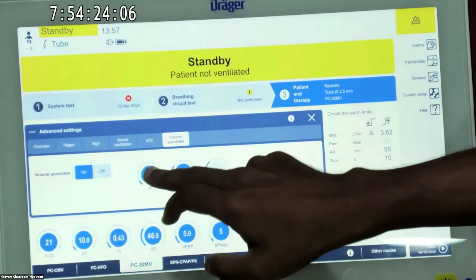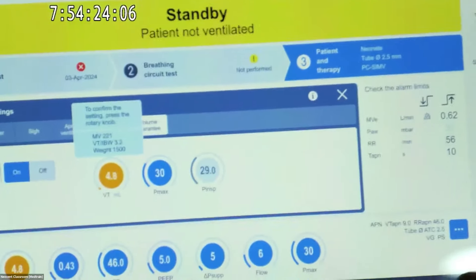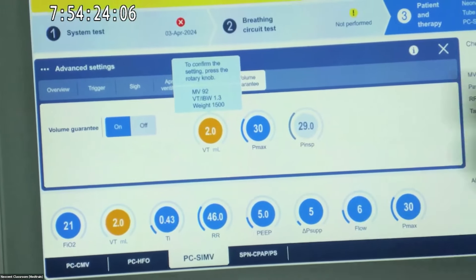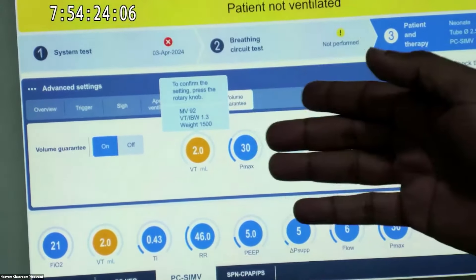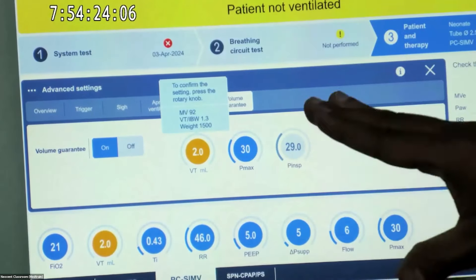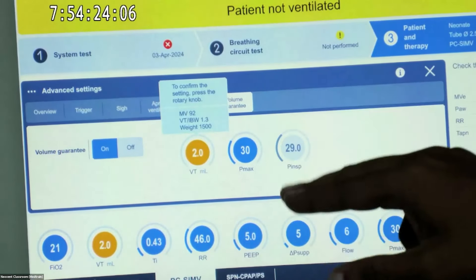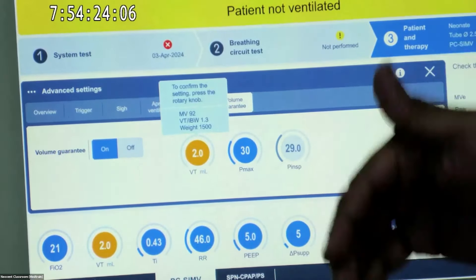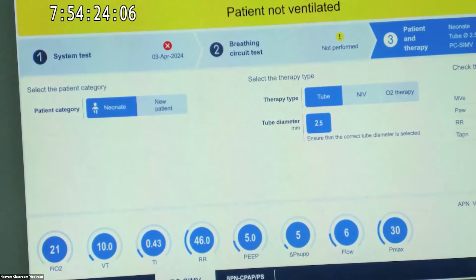Once we switch it on, we can set the total volume. The minimum tidal volume starts from 2 ml, so from 400 grams we can start this ventilator, up to 100 ml maximum limit for volume guarantee. We also set the P-max — the reason we set P-max is so that it doesn't exceed the upper airway pressure, as a safety measure.